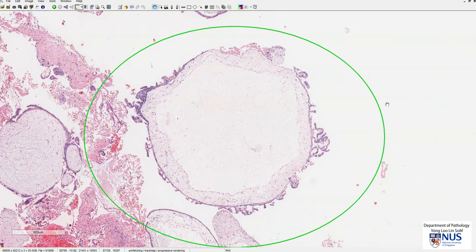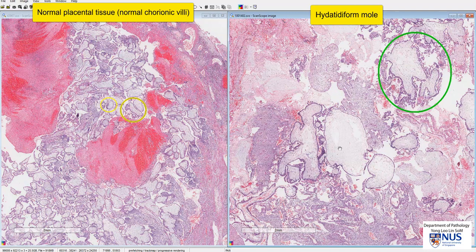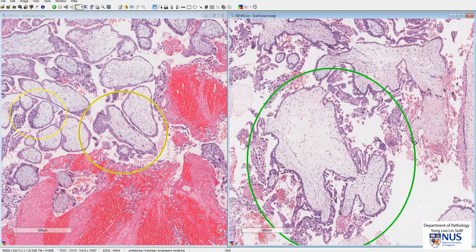We will now do a side-by-side comparison with normal placental tissue. On the left, we have a case of tubal ectopic pregnancy showing the wall of the fallopian tube, with normal chorionic villi from the placenta. This is taken at the same magnification as the hydatidiform mole on the right. The diameter of the normal villi is much smaller than the hydropic swollen villi seen in the hydatidiform mole. There is also no cistern formation, and trophoblast proliferation is only seen at one pole of the villus, as opposed to the circumferential trophoblastic proliferation seen in hydatidiform moles.